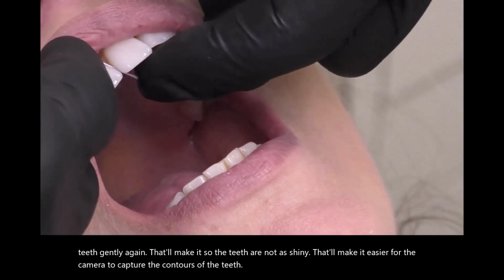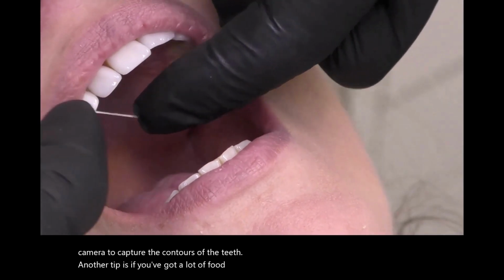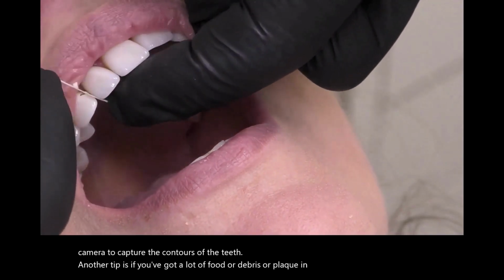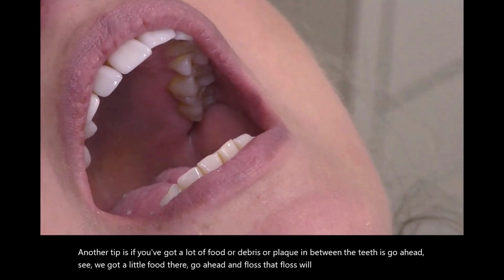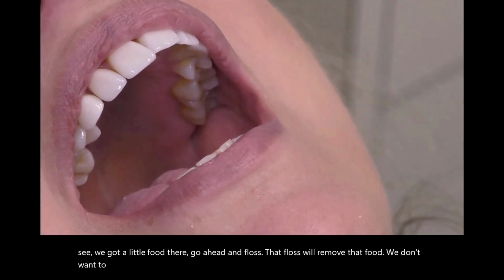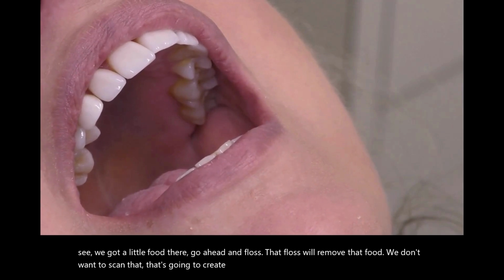Another tip is if you've got a lot of food or debris or plaque in between the teeth, go ahead, see we got a little food there, go ahead and floss. That floss will remove that food. We don't want to scan that. That's going to create discrepancy in our intraoral scan.